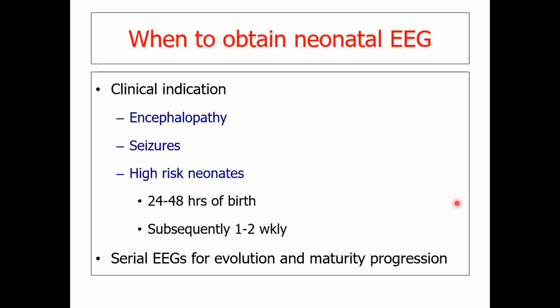So there comes the role of continuous EEG monitoring, where the EEG is compressed in as far as time is concerned, and in case there is a doubt that there has been a seizure, that part can be expanded, or the neonate can be taken for a conventional EEG.